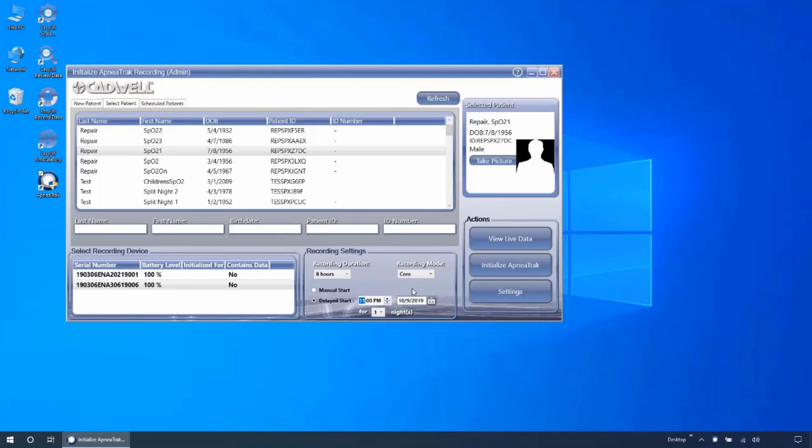The device can be configured to start for multiple nights, with the device starting at the same time each night. The device can also be configured to begin recording several days from initialization.